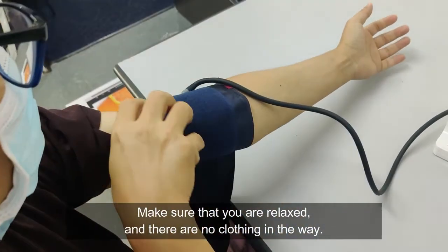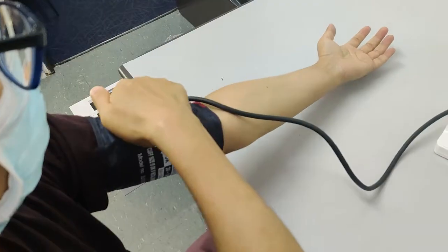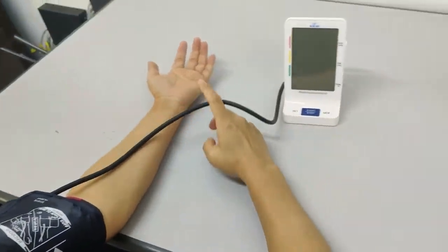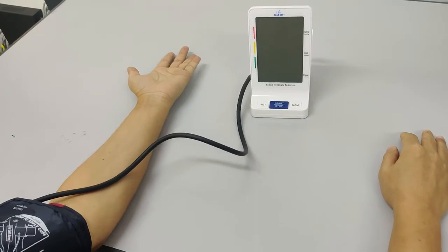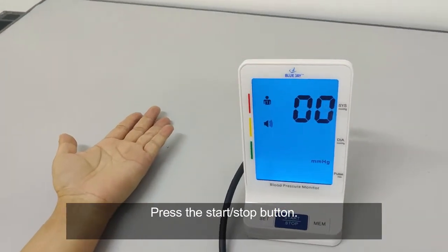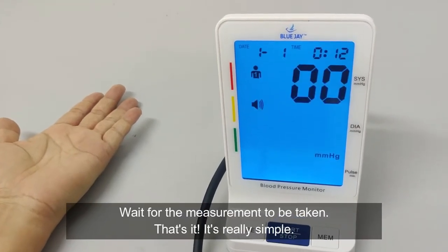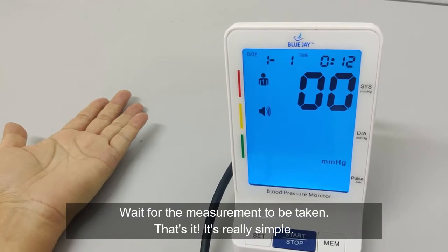Make sure that you are relaxed and there are no clothing in the way. Press the start or stop button. Wait for the measurement to be taken. That's it — it's really simple.